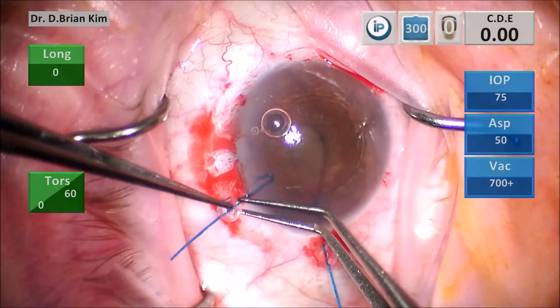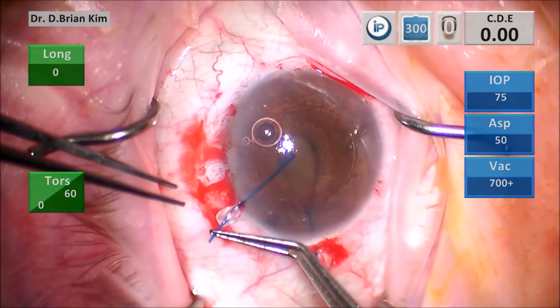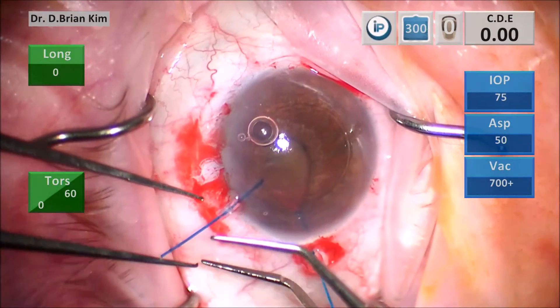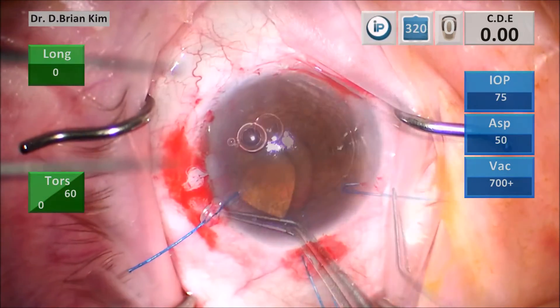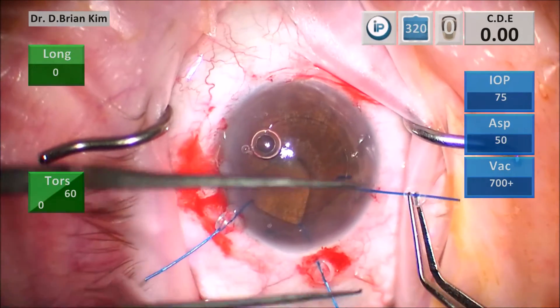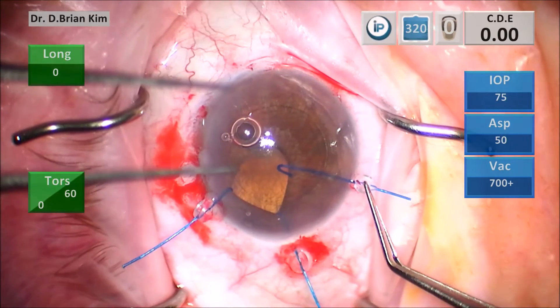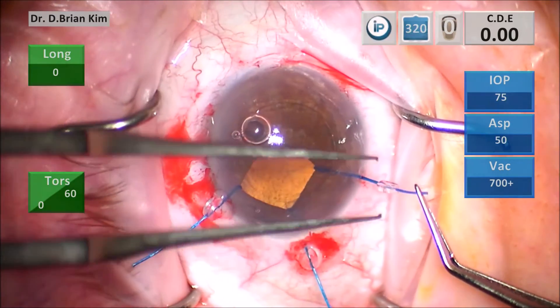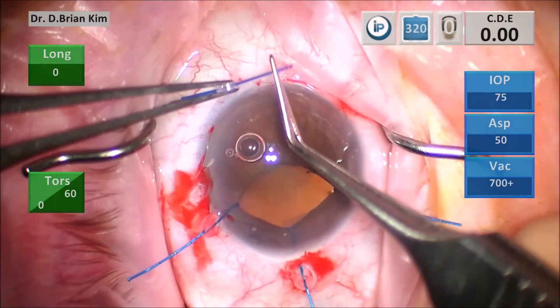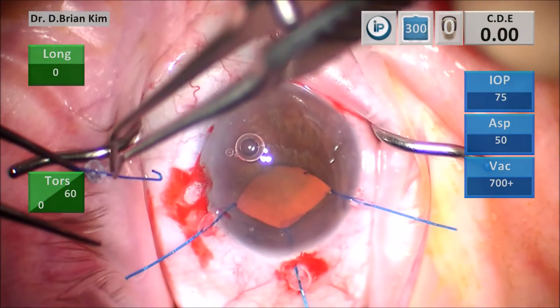With cases of zonulopathy and small pupils you don't want to use a Malyugin ring or any type of ring that only fixates and dilates within itself, because those devices retract the pupil only within themselves, whereas an iris hook fixates along the scleral wall. With rings you can also have inadvertent disengagement during your surgery, so iris hooks provide much more stable retraction of the pupil.